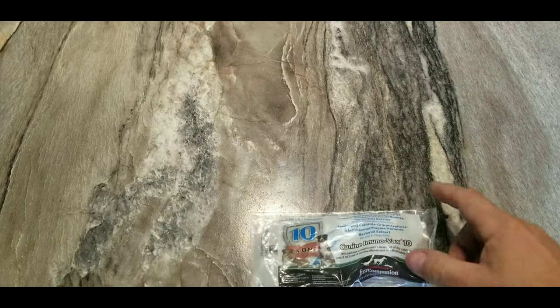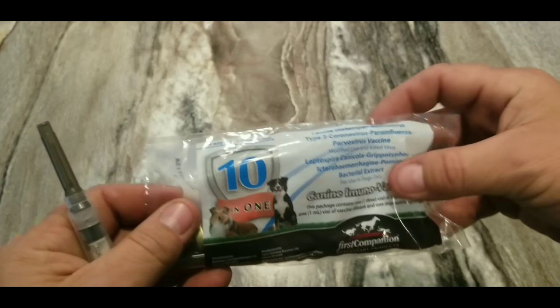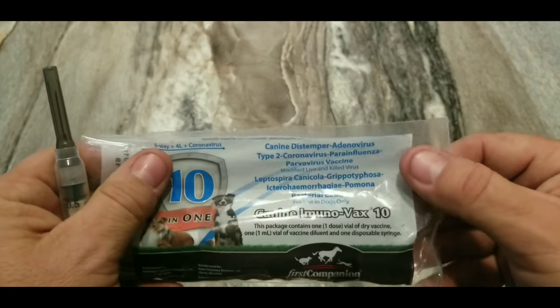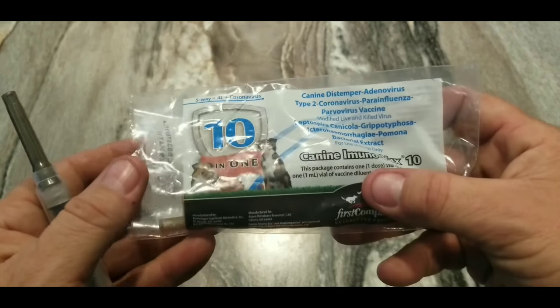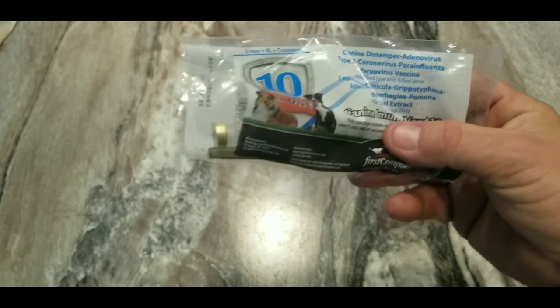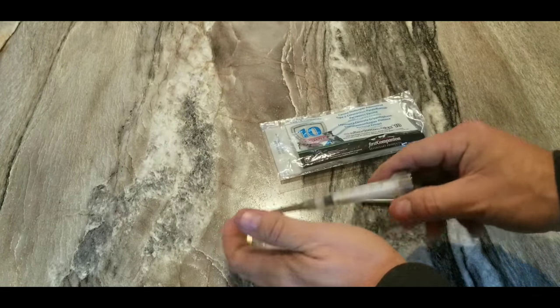I'm going to show you how to give your dogs their shots today. These canine distemper shots are 10-in-1, to protect your dog from all its little problems. They're sold at farm supply stores.